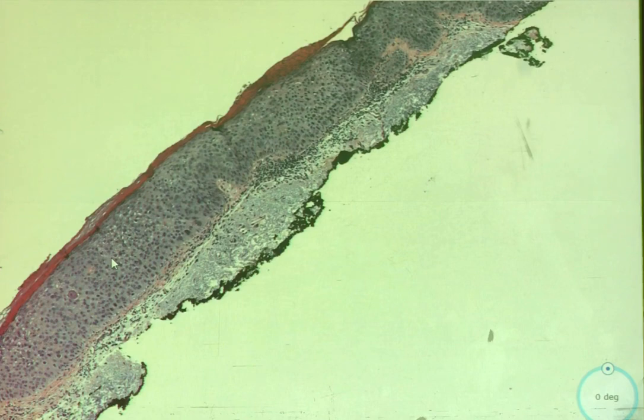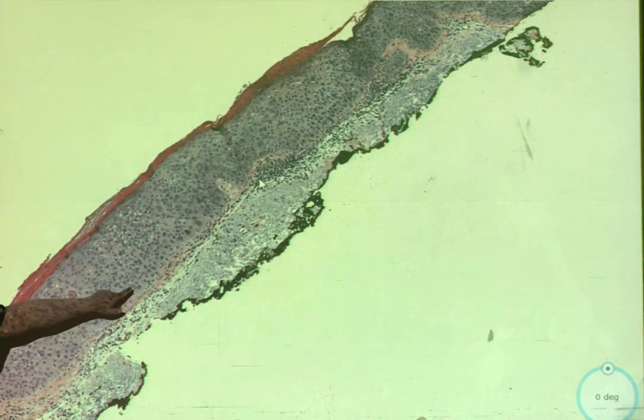The epidermis is larger than usual. Right, it's acanthotic. And here, the basal layer, is this the basal layer? No, it's the basement membrane. I think you're higher than the basement membrane. Yeah, you're on the basement membrane. And something's sticking out, right? I think you see it. There's something right there in the middle, right where your mouse pointer was just a moment ago. Something that's sticking out at you, right? Like there's a trio of them.